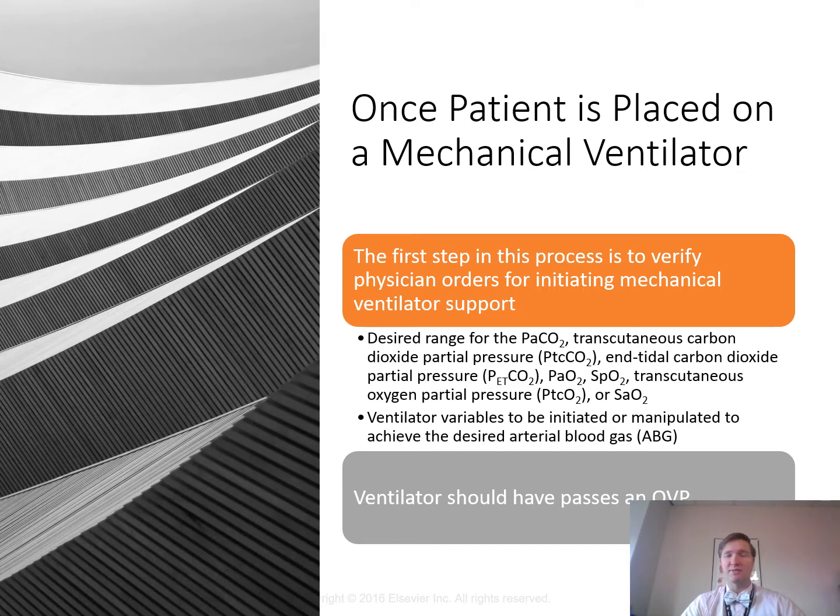Is the respiratory rate really, really fast? Are they riding the machine, letting the ventilator do 100% of the work? Is their breathing pattern appropriate? Are they using accessory muscles still? Believe it or not, if your vent settings are inappropriate, you can still have the patient use a lot of accessory muscles. What's their chest movement? Do they have a seesaw pattern? Do they have retractions, especially in pediatric patients?